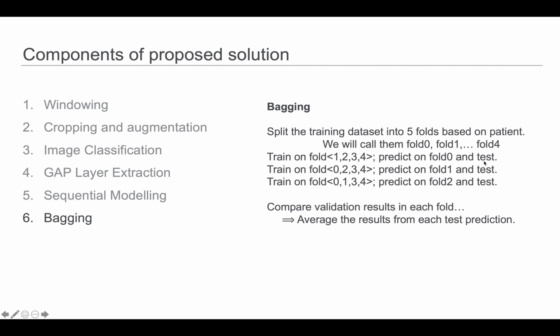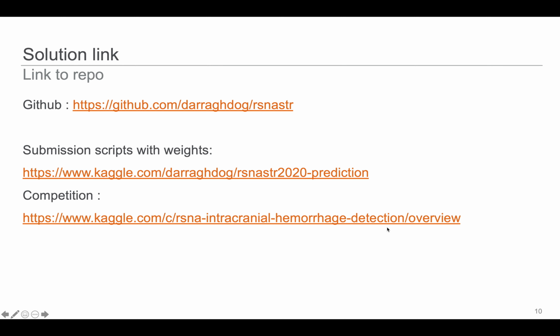You can see how the fold is done. It's with out-of-fold samples, and for every fold we got an EfficientNet and those 3 models, and then in the end averaged the results of all the folds and all the sequential models.